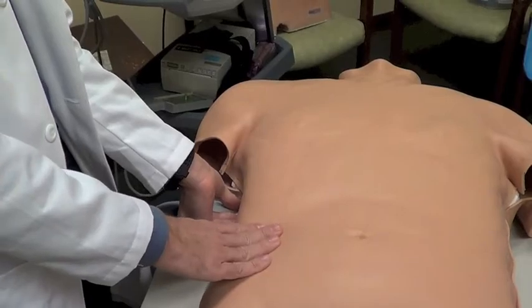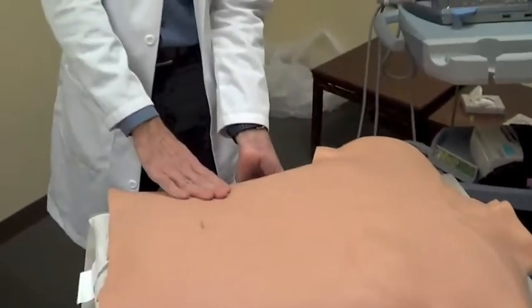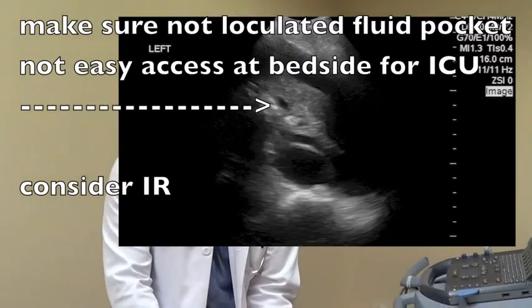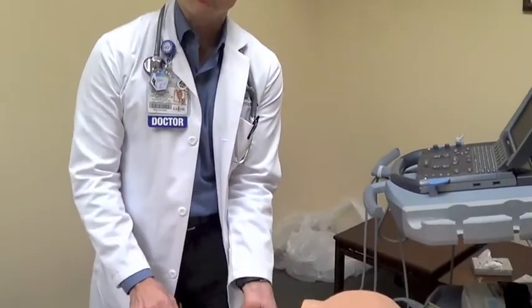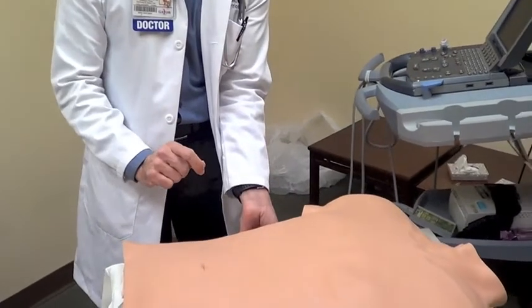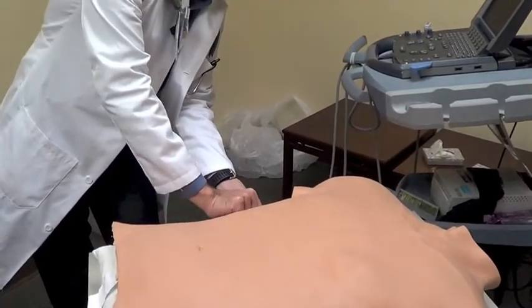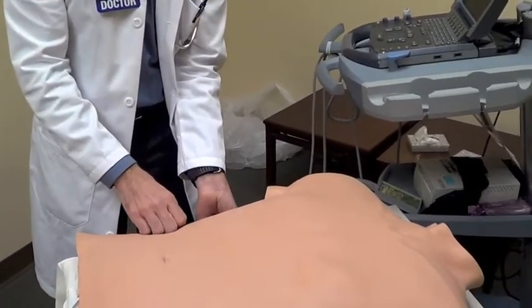For the purposes of accessing this fluid pocket, I'm going to ask and ensure that the patient stays in the exact same position while I then take my finger and palpate the point of entry. I then take my marker and make a mark at the approximate site where I'm going to put the needle.